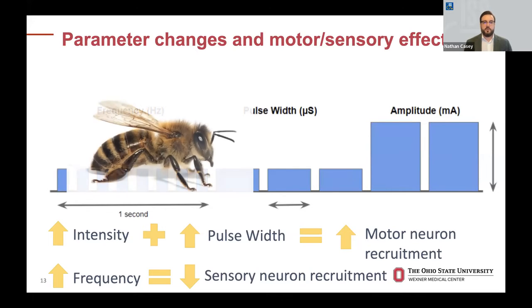I've had some patients almost liken it to kind of like repetitive bee stings if it's at a high level and if they have good sensation. So obviously that's a little bit of a barrier. We don't want to hurt our patients. We don't want them to feel uncomfortable.